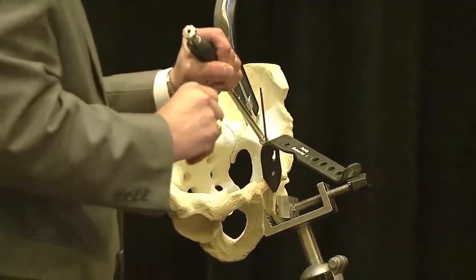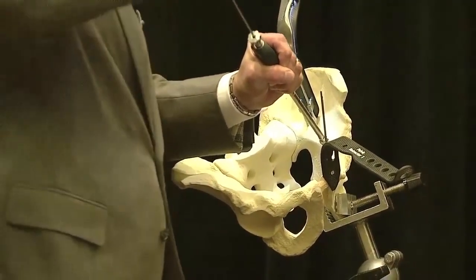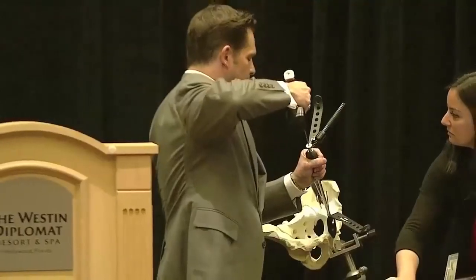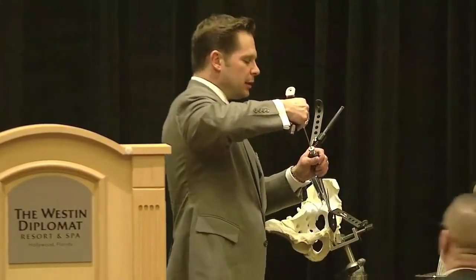I'm coming in through the wound. I have it reduced. You can see the instruments are pretty long because they have to work through the cannulas and we use a lot of long screws. So now I'm going to put this screw in. I'm working through the wound as Claude has exposed it. We're going to put that washer and lag screw. So we're drilling, and these are calibrated so we can measure right off the device.